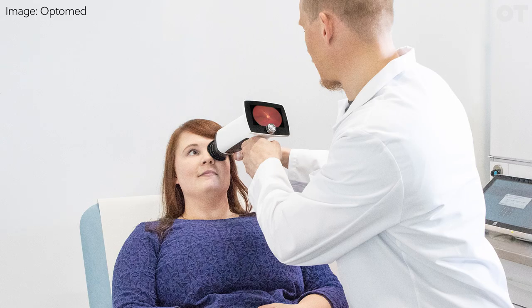Those cameras are non-mydriatic, so there is no need for dilation. It's really built for those places that haven't done those screenings before.